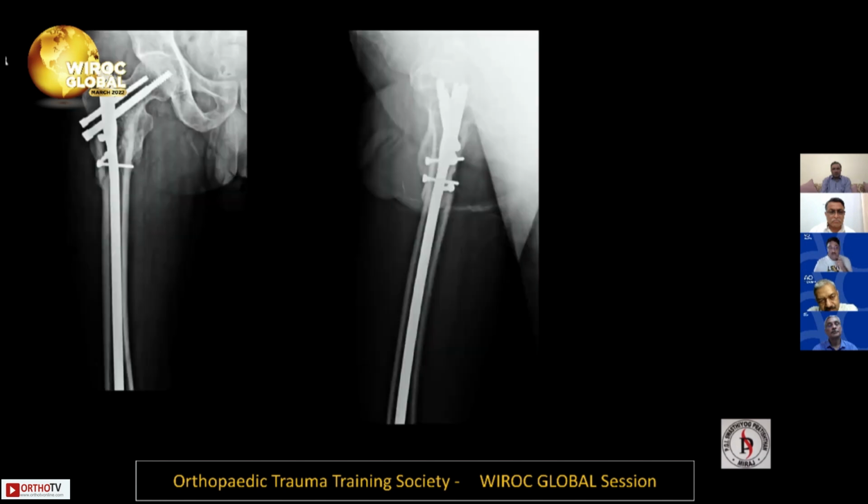But we reduced it again, because we couldn't change the implant because of financial problems. The fixation of the lesser trochanter around the subtrochanteric area is very important. Most of the time it is absolute stability, which is now the crux of the success for the subtrochanteric area.